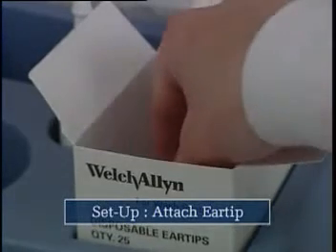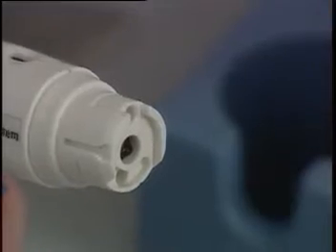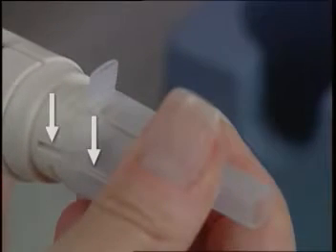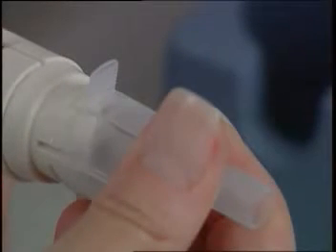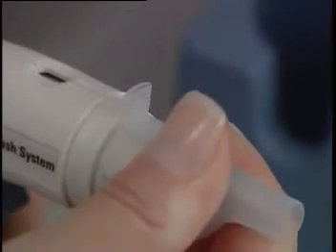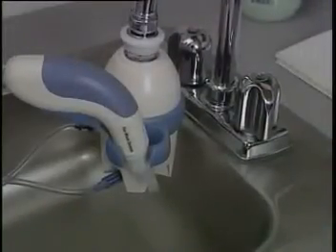To complete the setup, attach a disposable ear tip to the interface on the irrigation handle. Line up the grooves on the side of the ear tip with the corresponding indentations on the handle interface. Making sure that the tab on the ear tip is on top, press firmly on the ear tip until it is flush against the handle interface. Now you're ready to use the ear wash system.